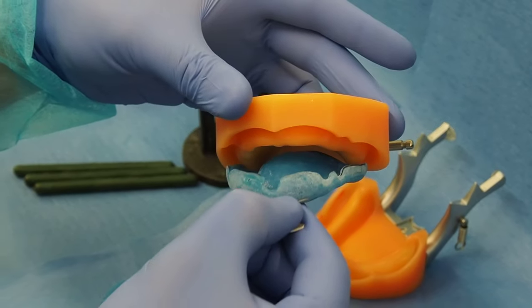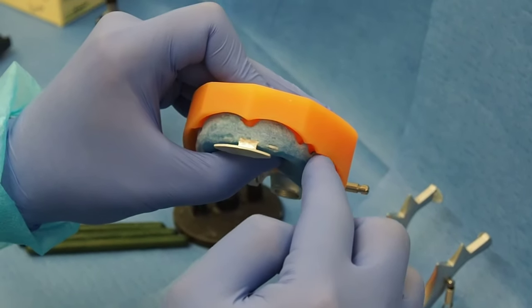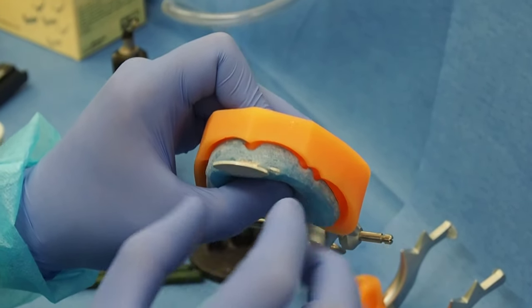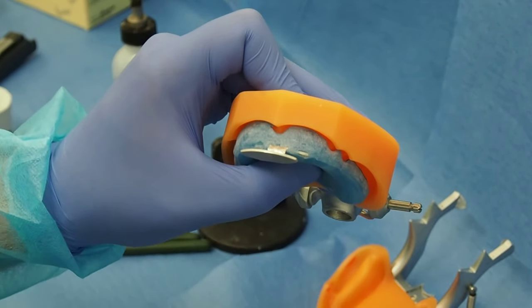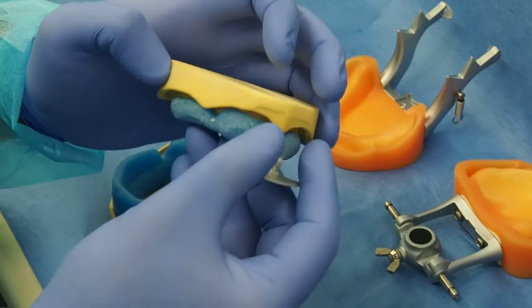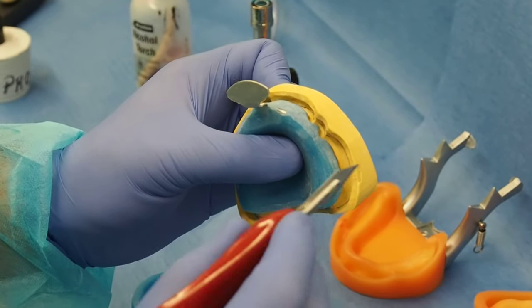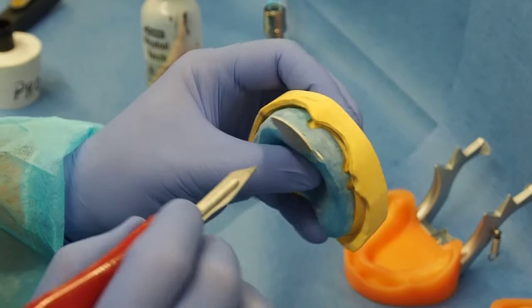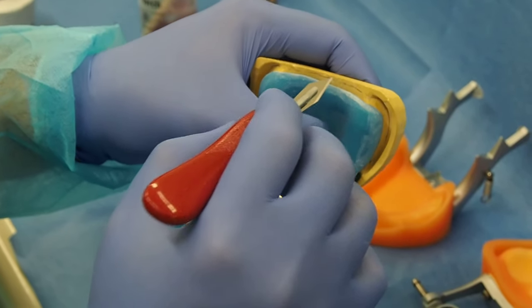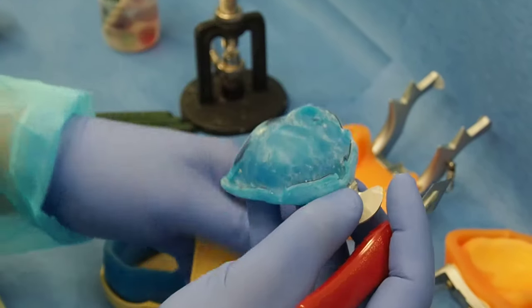Then we'll take a mirror and look into the vestibule and make sure everything is stable and short to it. This is the whole purpose for this. If you see where you mark the limits on your overextended model, it's always short.